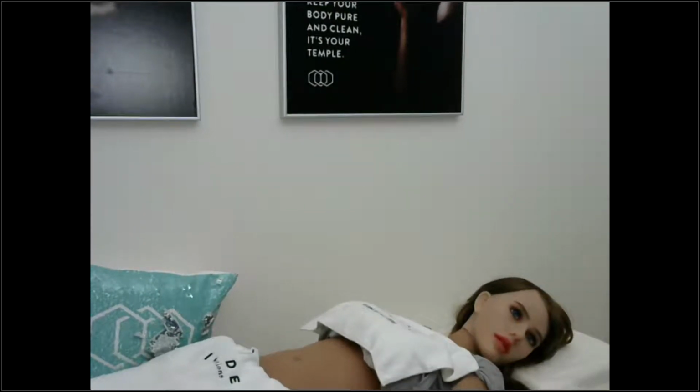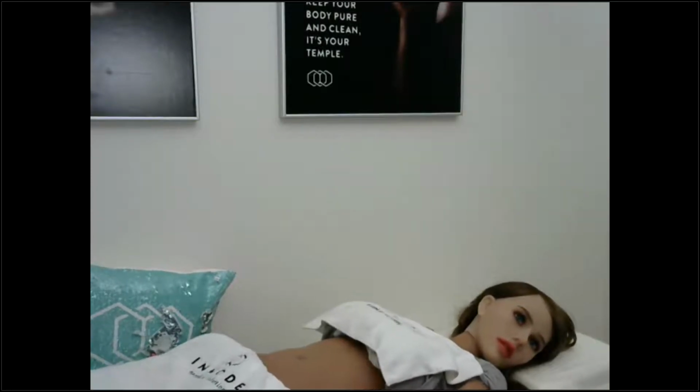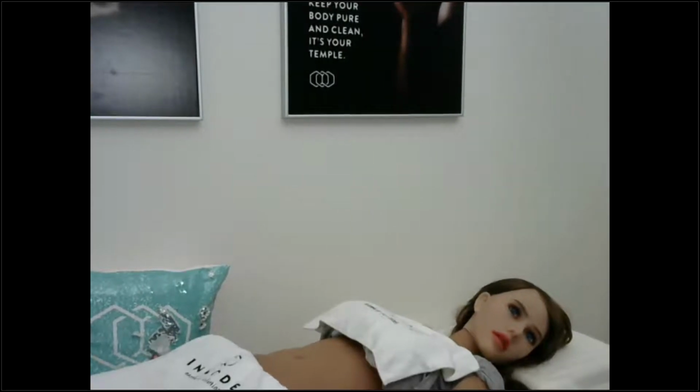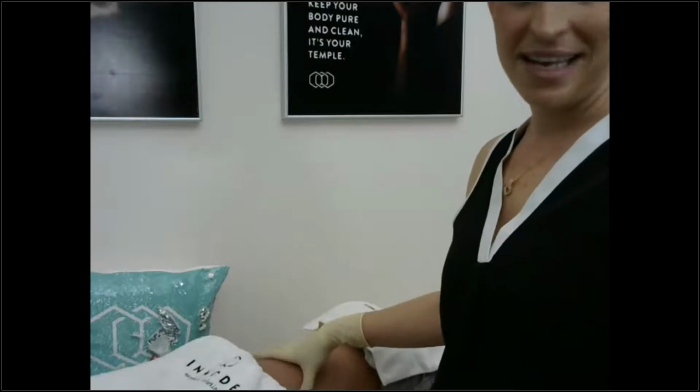We talked about the size of a treatment area for the body, and I said the smaller area for body would be 8 by 8 centimeters, and the larger treatment size would be 12 by 12. Normally what I do is mark the treatment zone with a ruler and a marker or a makeup pencil or something like that. But today we're just going to, I shouldn't use a marker, right?